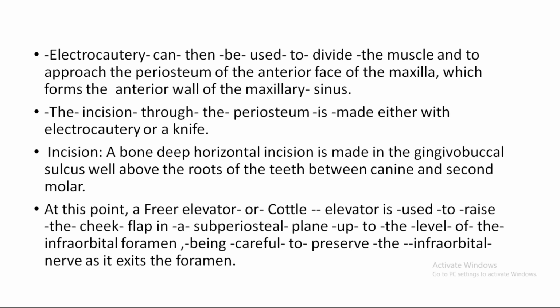This is the reason why infraorbital nerve injury is frequently seen. Those who are not careful while elevating the flap may end up injuring the infraorbital foramen. So once you see the infraorbital foramen or the infraorbital neurovascular bundle, that is your superior limit of dissection. You have achieved it, being careful to preserve the infraorbital nerve as it exits the foramen.